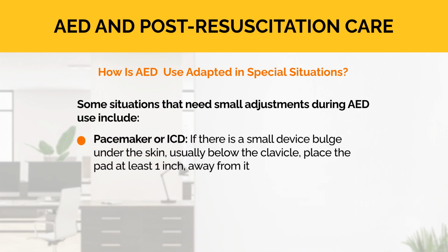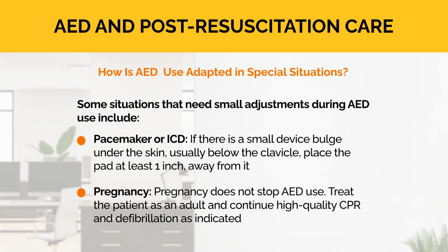Pacemaker or ICD. If there is a small device bulge under the skin, usually below the clavicle, place the pad at least 1 inch away from it. Pregnancy. Pregnancy does not stop AED use. Treat the patient as an adult and continue high-quality CPR and defibrillation as indicated.